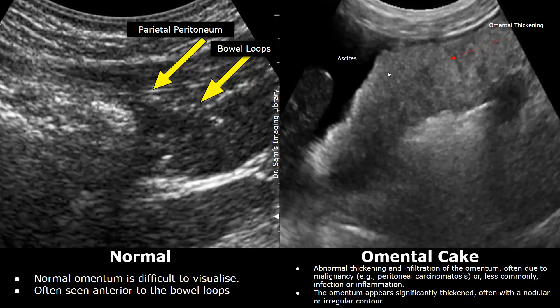Ovarian cancers and gastric cancers can infiltrate the omentum and lead to this type of appearance on ultrasound. It is less commonly associated with infections. In many cases, ascites may also be present.